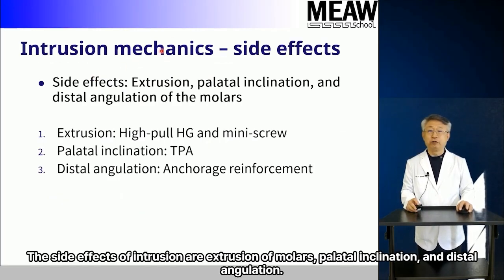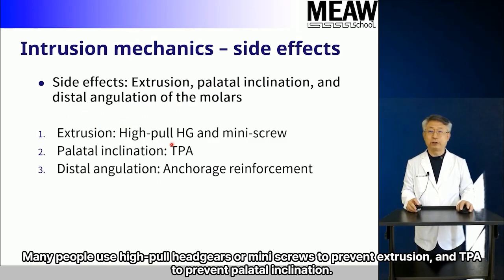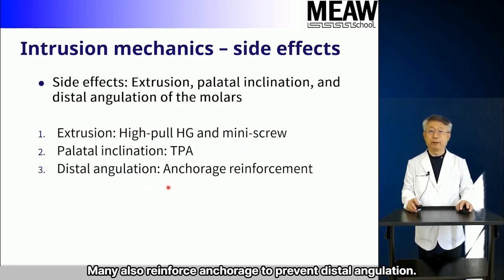The side effects of intrusion are extrusion of molars, palatal inclination, and distal angulation. Many people use high-pull headgears or mini screws to prevent extrusion and TPA to prevent palatal inclination. Many also reinforce anchorage to prevent distal angulation.